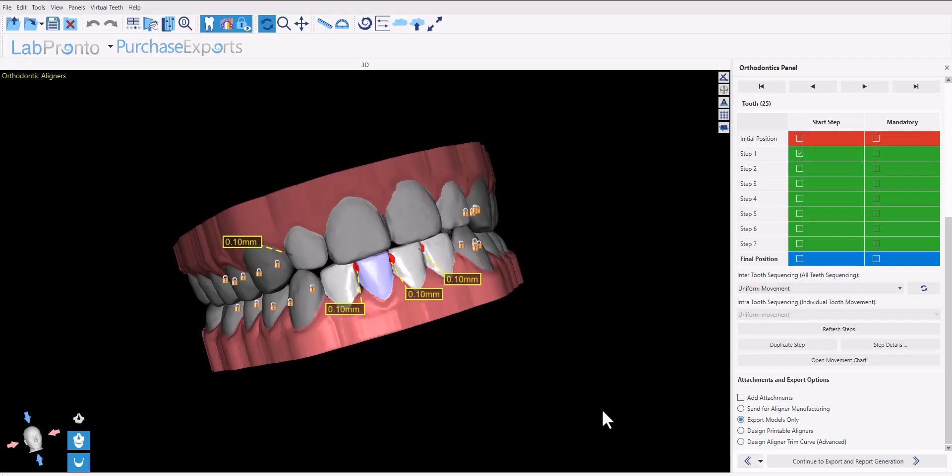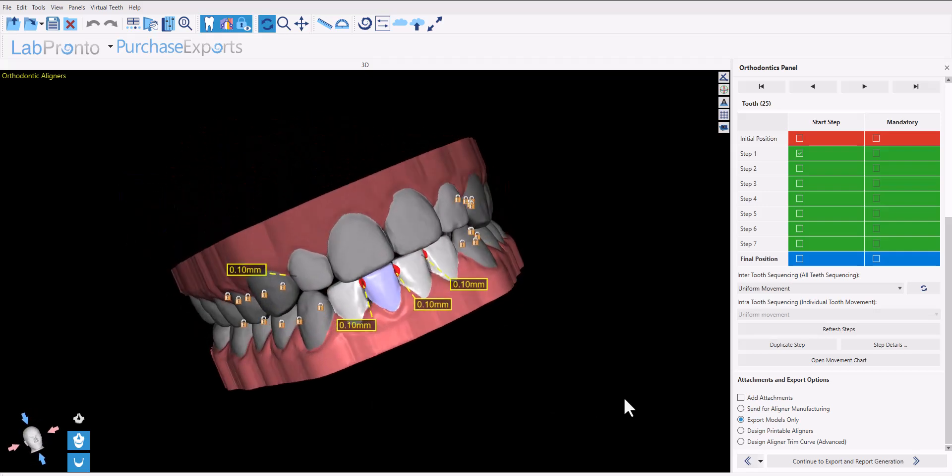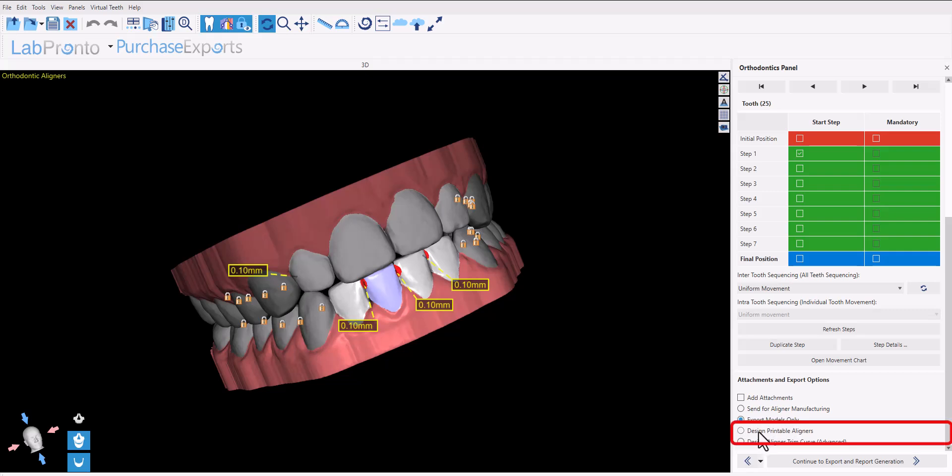Designing aligners for direct aligner printing is super easy in the Blue Sky Plan software. Once you complete the treatment plan, change the option from 'export models only' to 'design printable aligners'. There's no additional cost to design printable aligners.